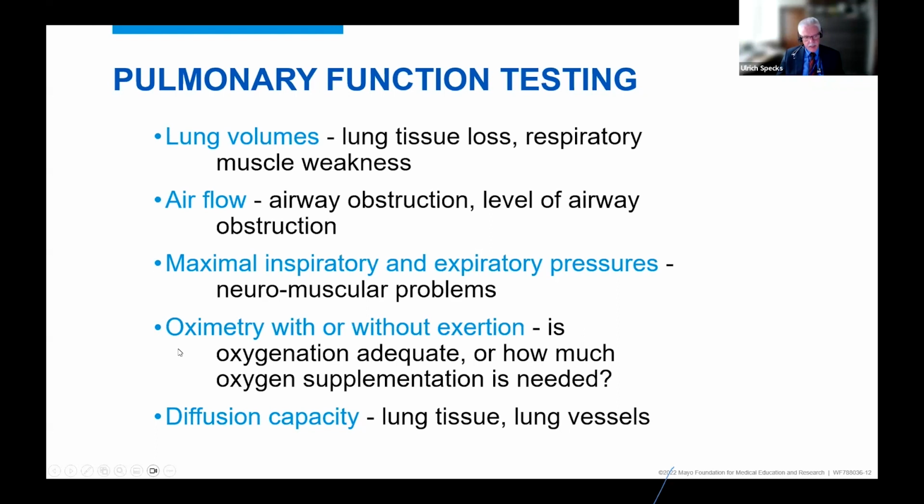Now, we also get numbers about your oxygen saturation and whether it is adequate or reduced at rest or with exertion. And that tells us whether you may need any oxygen supplementation, either at rest or not at rest, but with exertion.